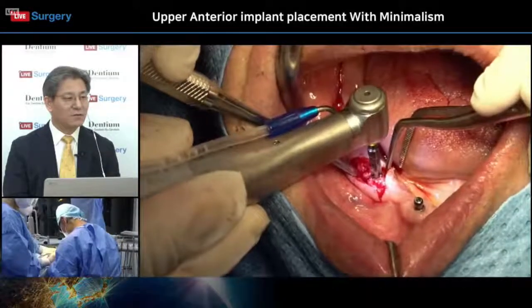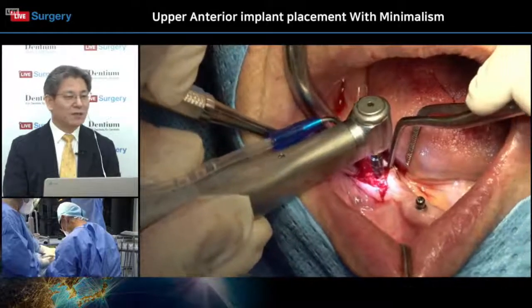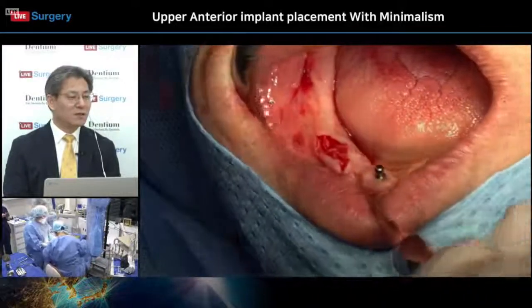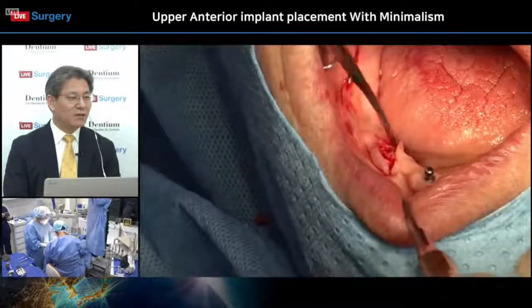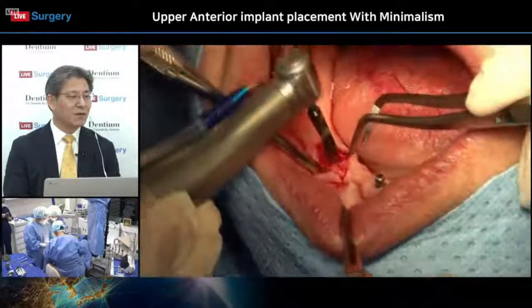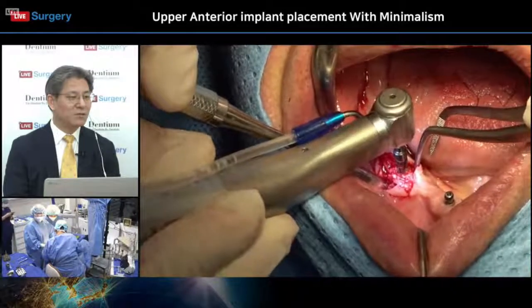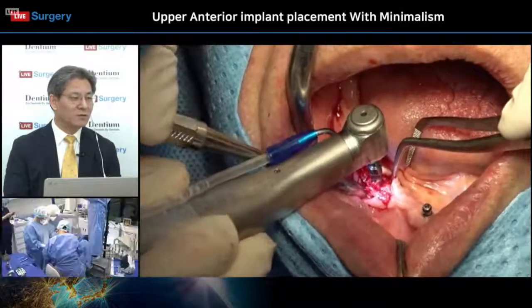Okay, so 10 millimeter, 11, 12 millimeter. Yeah. So he will try 4.0. Yeah, lingual bone is good enough. Okay. But due to injury, some defect on the labial side. So. Okay. I will try the 4.0. Oh, 4.0 diameter. Number 12. Number 11. Yeah, number 11.